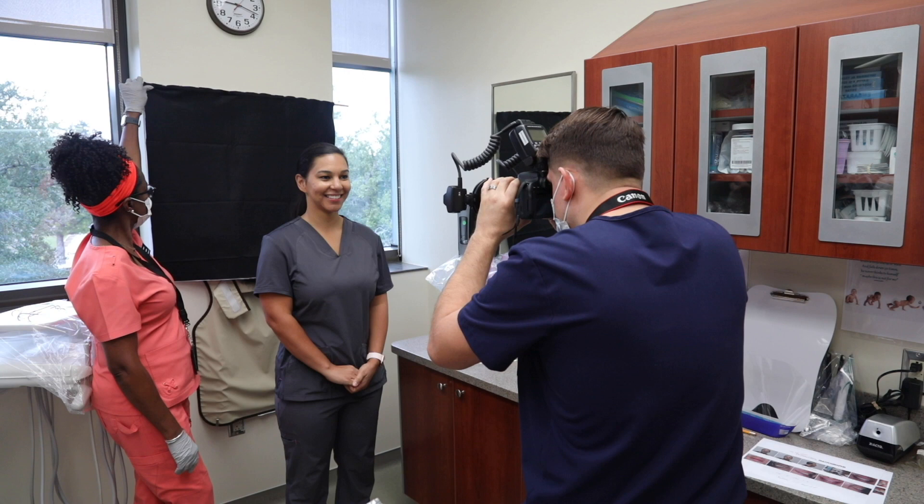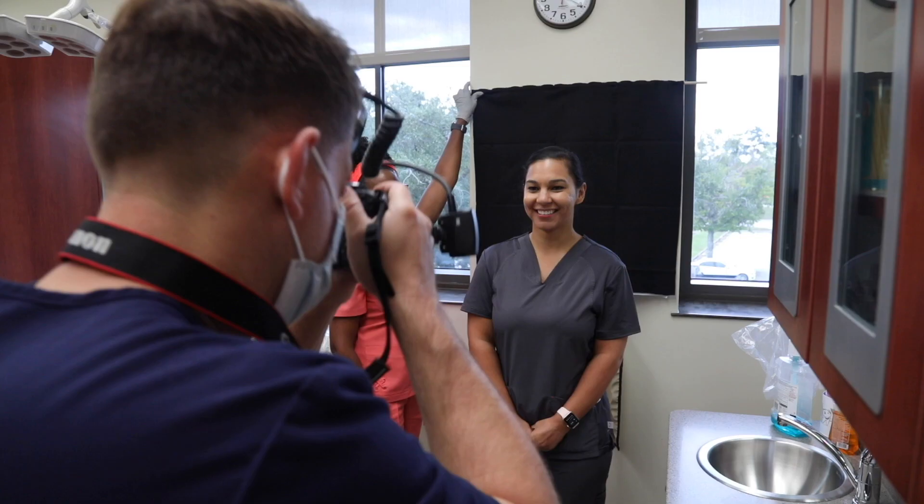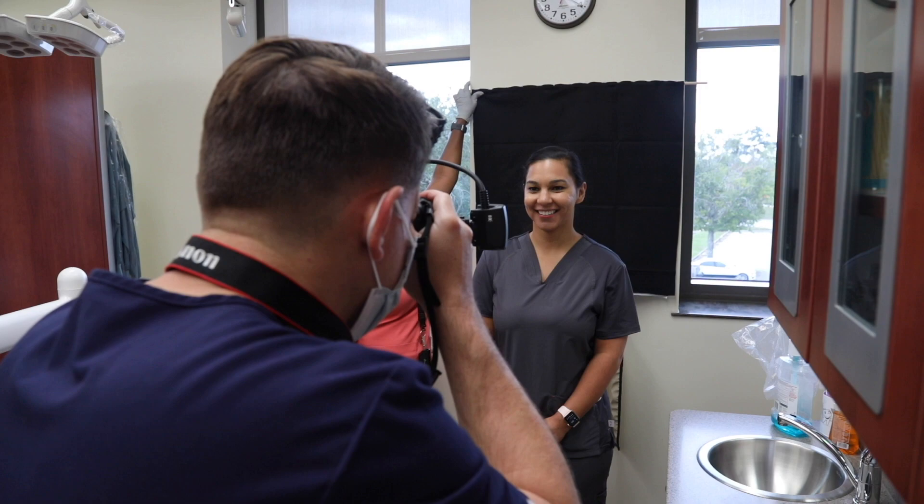Using the same orientation as the full face repose, the only difference between this smiling image and the repose image is the smile — everything else is the same. Smiles can vary among patients. I always try to capture a natural smile, but documenting an exaggerated or big smile is good as well.